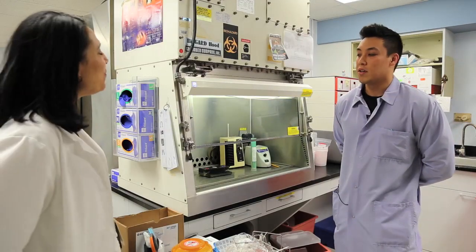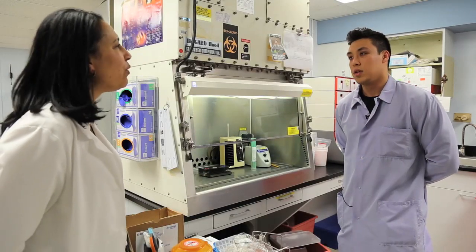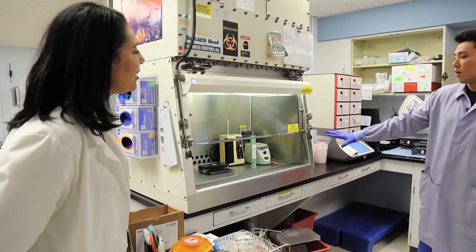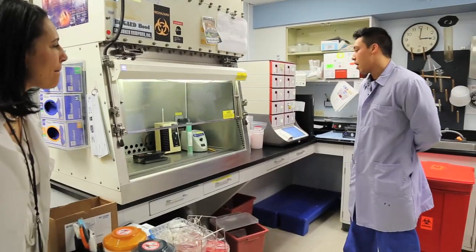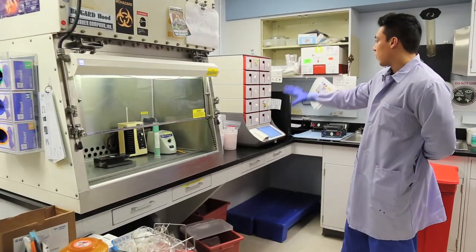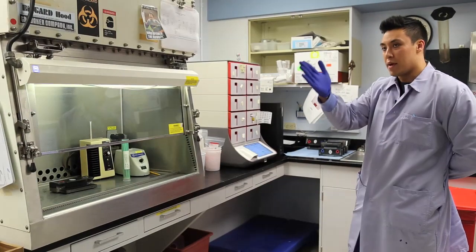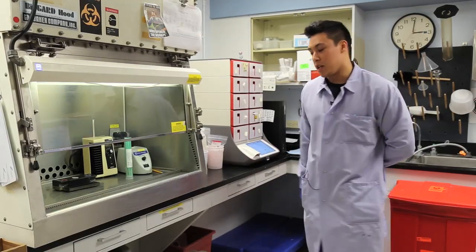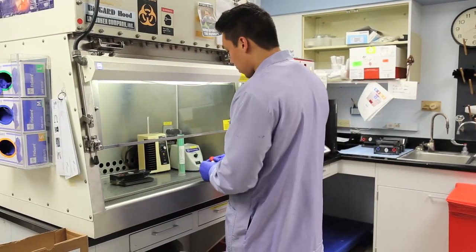Of course. So would you be able to show us how you set up a sample? Of course, I'd love to demonstrate for you. To our right of the hood, which is difficult to see, we have the materials for the respiratory panels. We keep it separated from other assays such as the GI panel, and behind you would be the meningitis panel. We also do have blood panels by the respective blood bench. So we do have a respiratory panel sample here, which I will show you how to run.